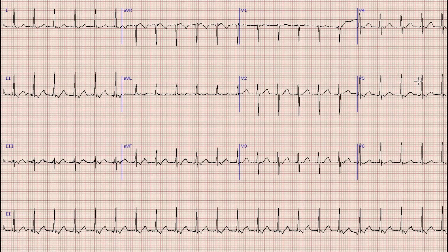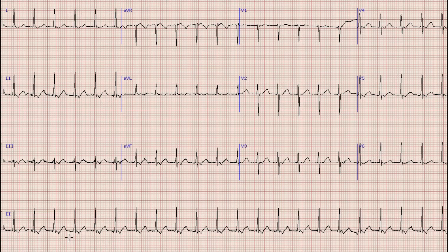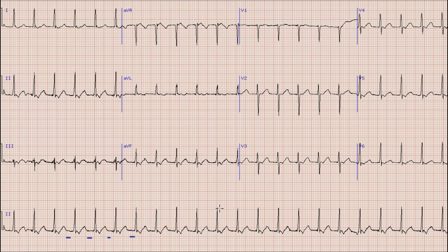For a rhythm to be sinus tachycardia, there should be upright and prominent P waves before each QRS complex in inferior leads, especially in the rhythm strip — that is, lead II. Here we can see that there is no P wave before the QRS complex. The absence of P waves before the QRS complex means that this is not a sinus rhythm.